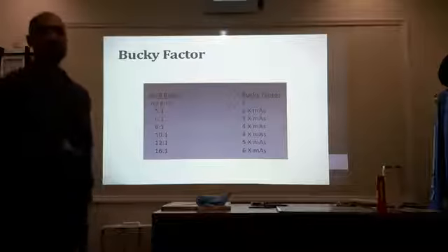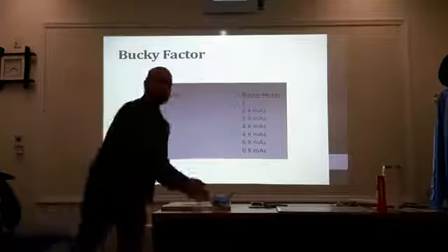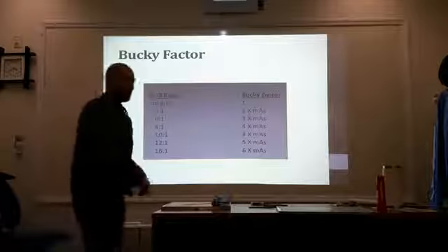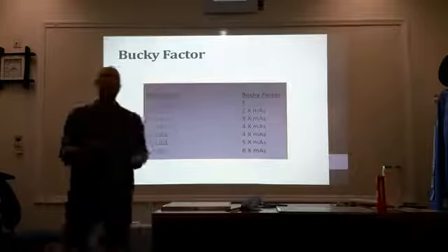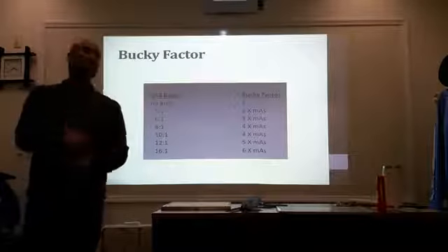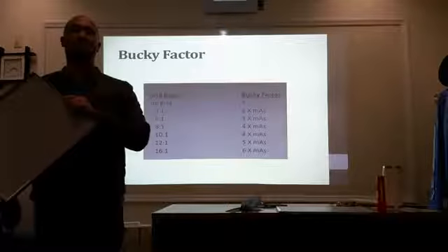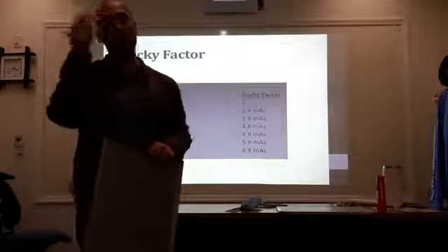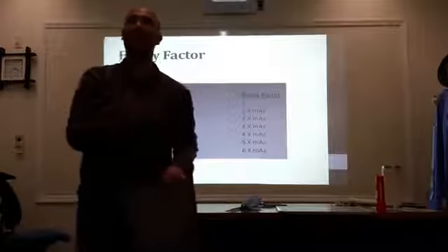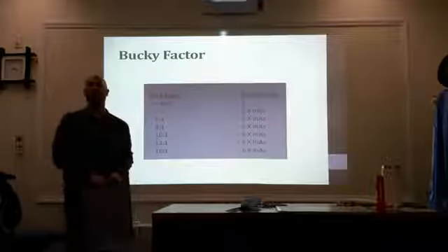What the heck are you talking about, Dr. F? Okay? Well, let's just say, for example, I'm going to the emergency room. In my department, I have a set of technical factors that I know will work each and every time without a grid. But now I'm going to be bringing my grid along with me to the emergency room or the operating room. Knowing what I know about my original technique that works in the department, I'm out of my department now. So what type of modification do I need to make with my technical factors to give me the proper density on my film?